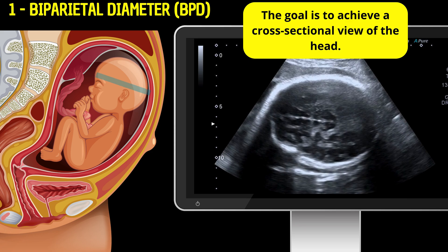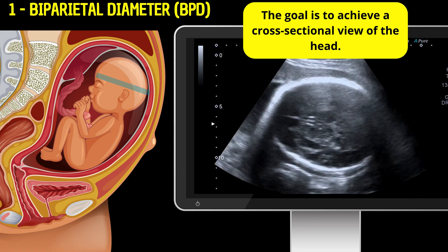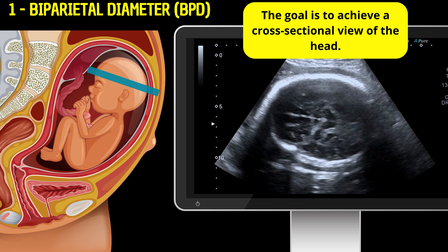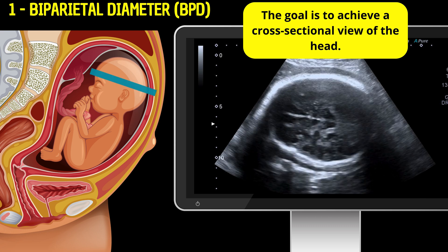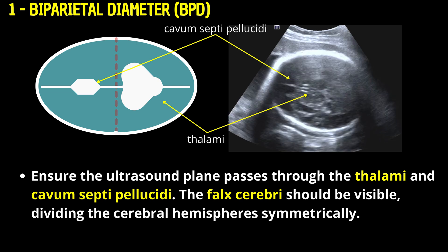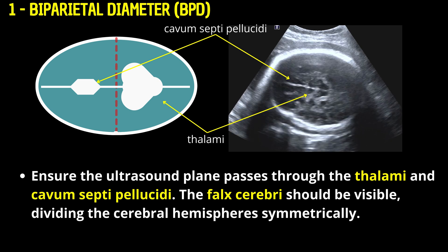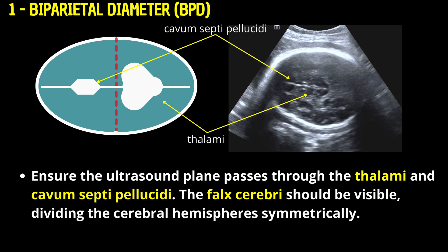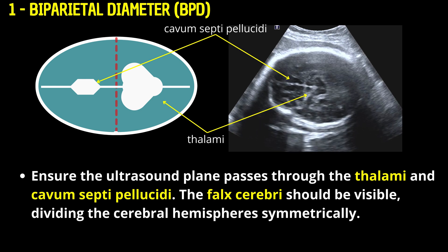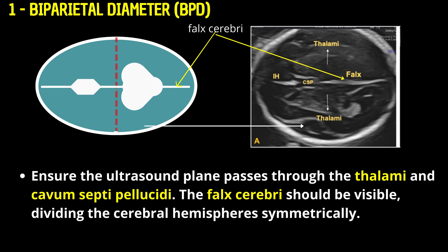Biparietal diameter — positioning the probe: Place the probe transversely on the mother's abdomen, aligned with the fetal head. The goal is to achieve a cross-sectional view of the head. Ensure the ultrasound plane passes through the thalami and cavum septi pellucidae. The falx cerebrae should be visible, dividing the cerebral hemispheres symmetrically.